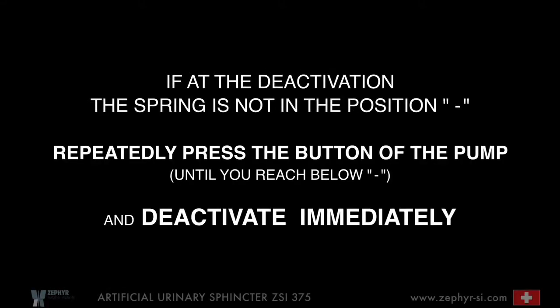If at the deactivation the spring is not in the position minus, repeatedly press the button of the pump until you reach below minus, and deactivate immediately.